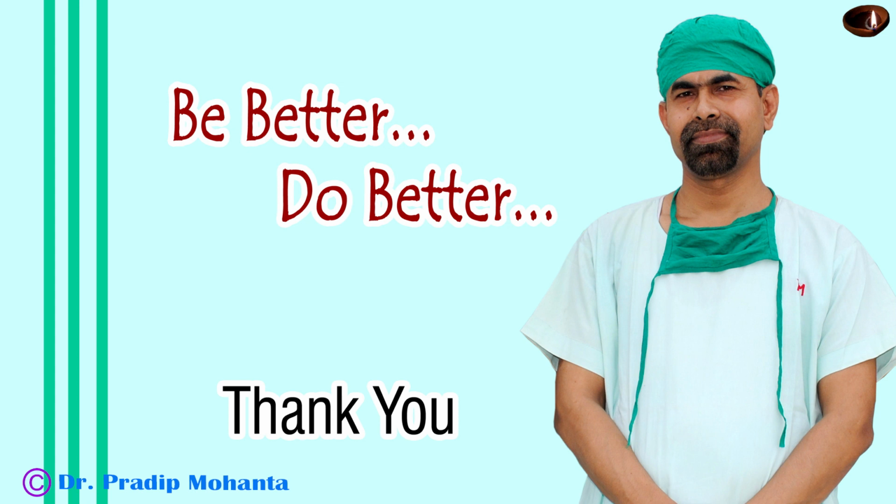Hope this video will help you in managing very hard cataracts where your intuition says that phaco is dangerous. Phaco may cause damage to the corneal endothelium. There can be posterior capsular rent, there can be nucleus drop, all these thoughts. When they come to your mind, you can go for this option. A large incision cataract surgery, actually it is modified ECCE. Two SICS wounds are constructed adjacent to each other, so it may be called DSICS, that is double SICS.